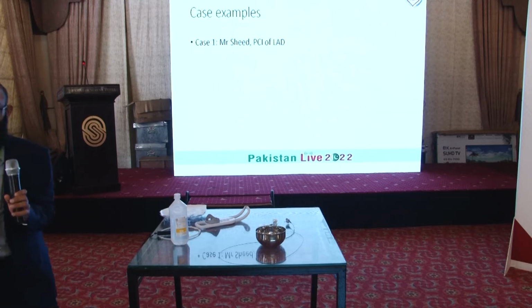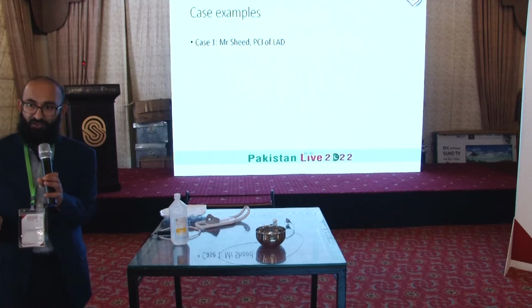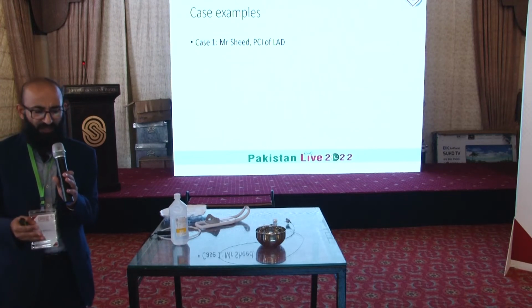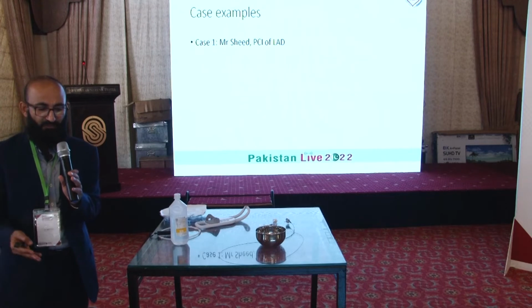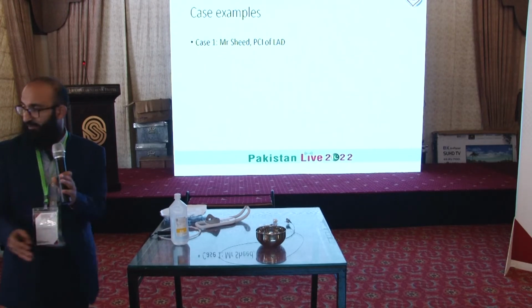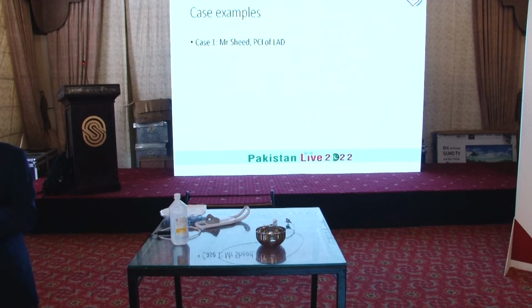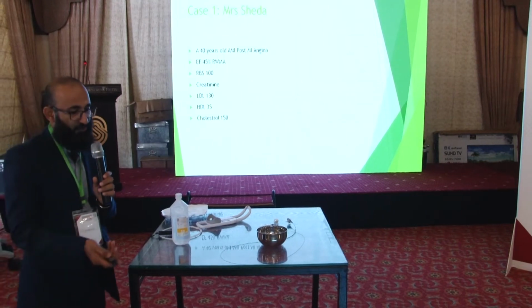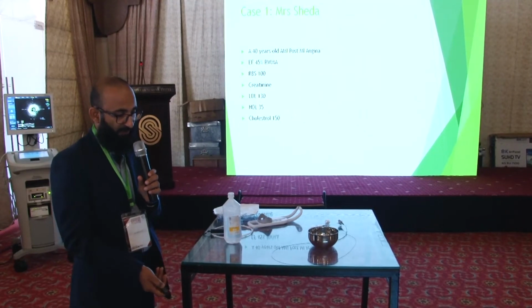So this was a very young gentleman, less than 40 years of age. He had an acute anterior wall MI, and he was referred after a day with ongoing pain to our outpatient. Then we brought him into the cath lab. Angiographically, this was giving the appearance of a moderate disease, but when we did IVUS, there was a calcific nodule. So this was a 40-year-old gentleman with ongoing pain.